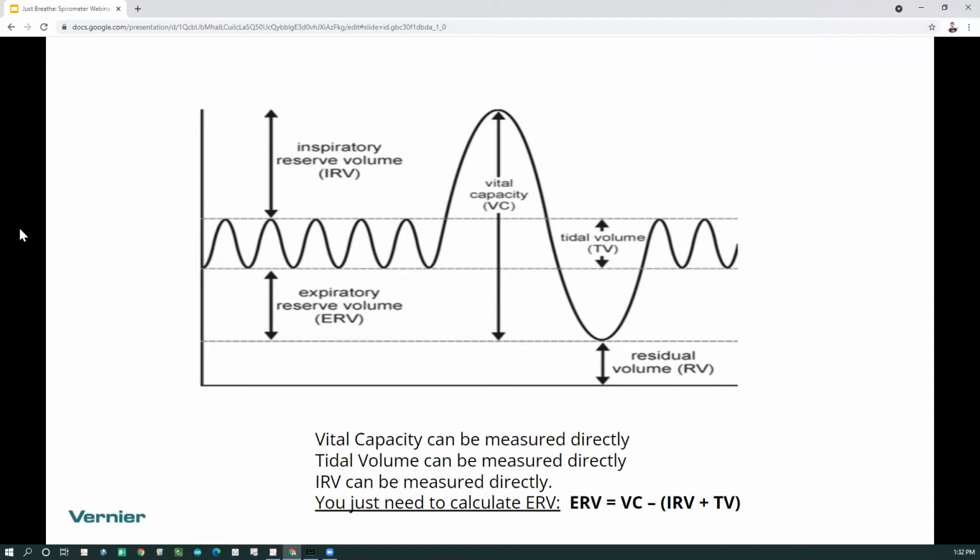All right, and we do have another question. What's the purpose of the final breaths after the big exhale? Since those values ended up below baseline, what can you use them for besides tidal volume? Oh, well, they're there just so that you can see recovery.